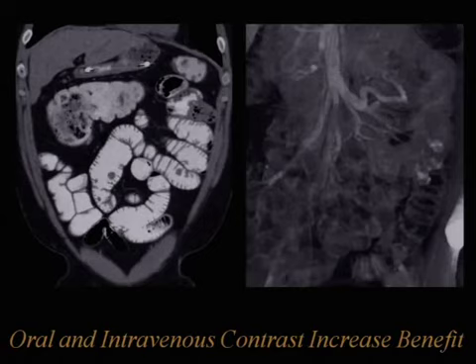But let me just show you two examples that we never saw when I just started on staff a couple of years ago. This is a patient with Peutz-Jeghers disease. The patient's undergoing a CT enteroclysis exam where we're injecting positive contrast through a nasojejunal tube. And look at the innumerable small polyps. These are all hamartomatous polyps in the small bowel.